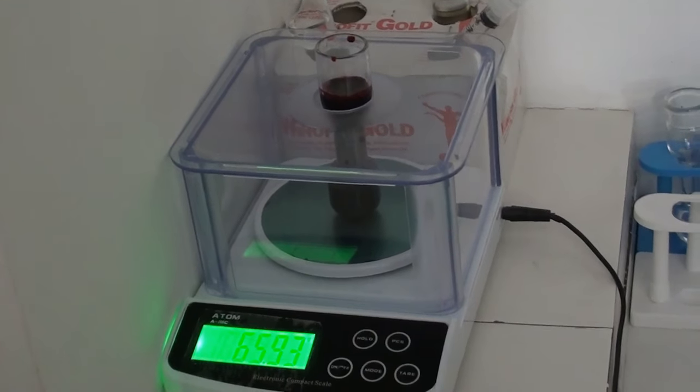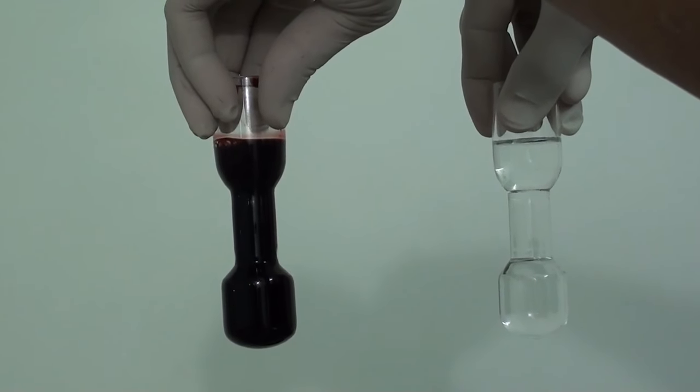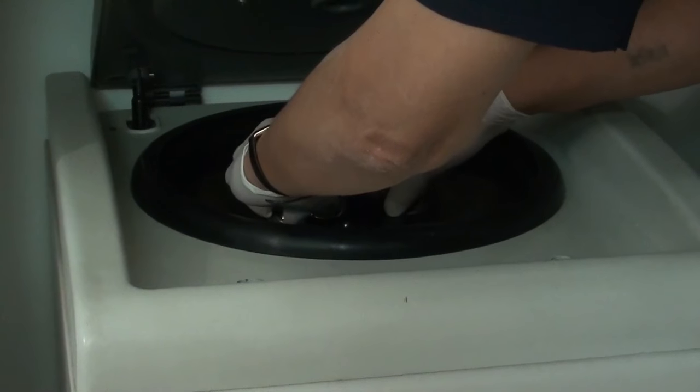Now take the weight of it, and take an equal amount of saline to neutralize it for perfect centrifugation.